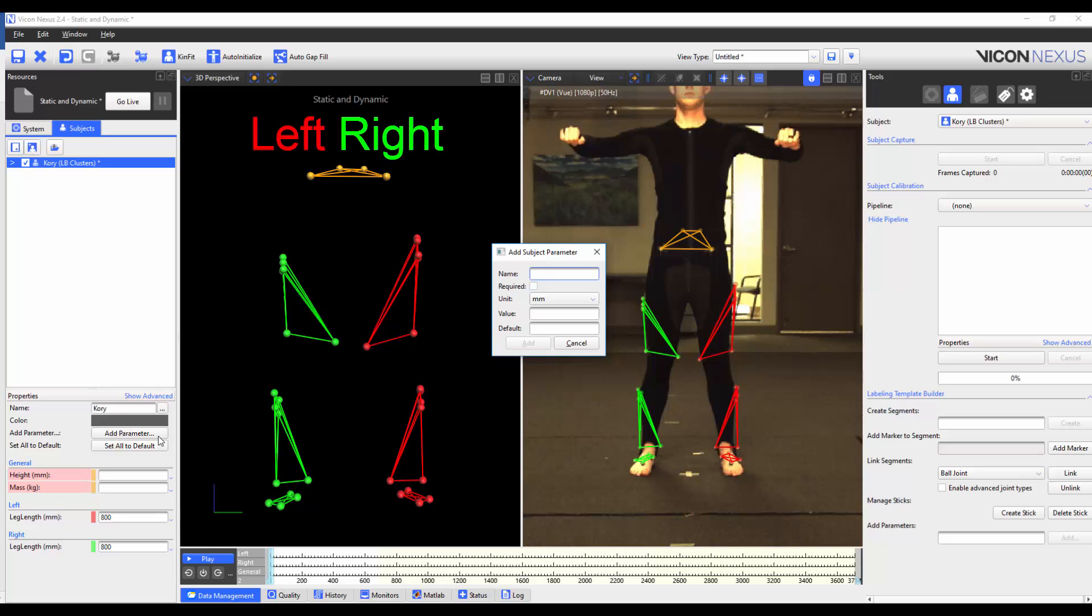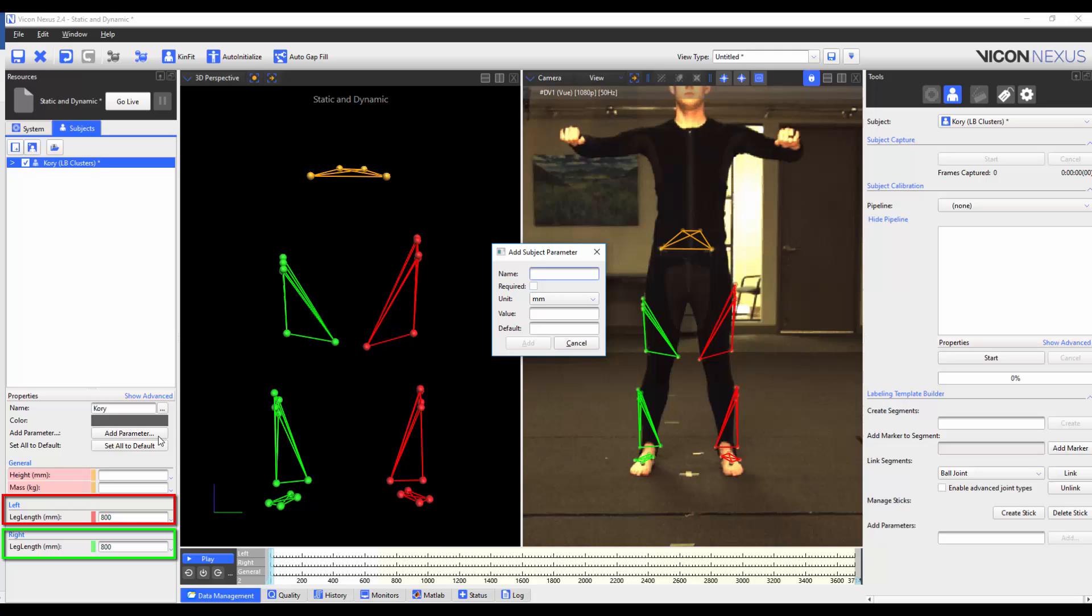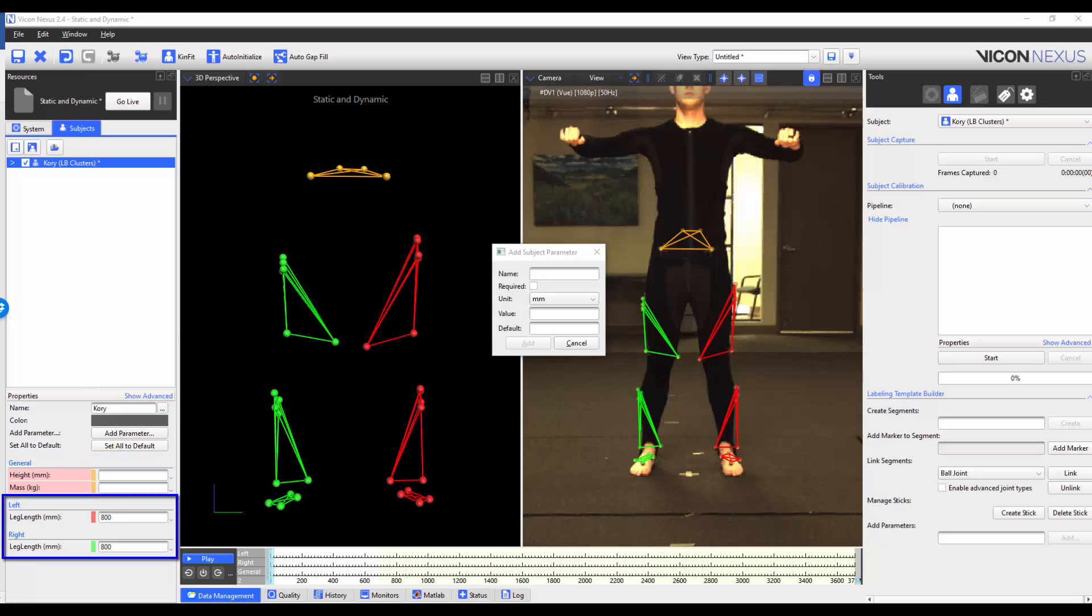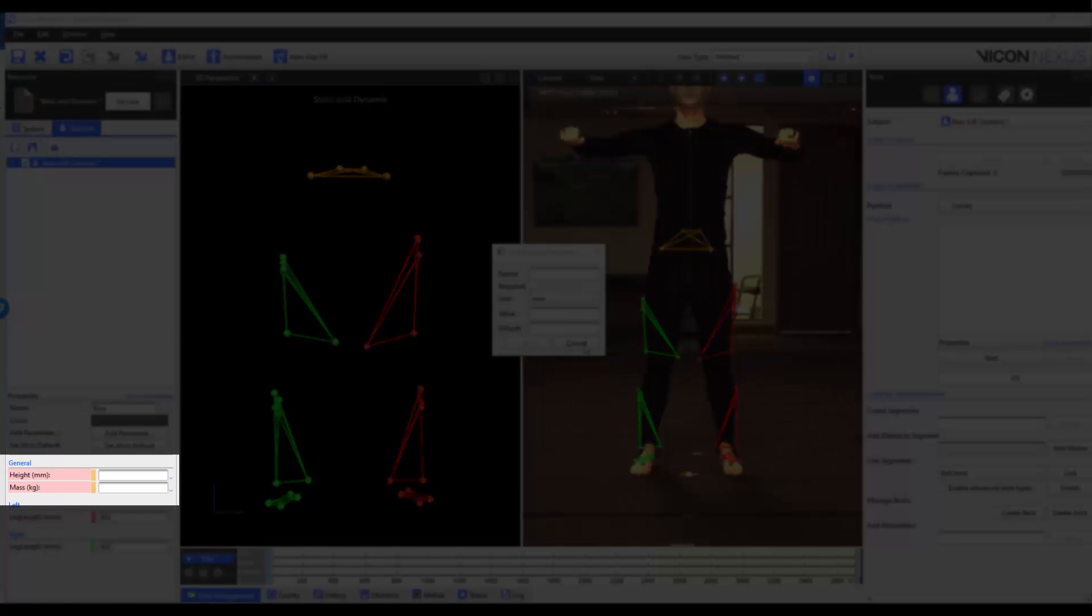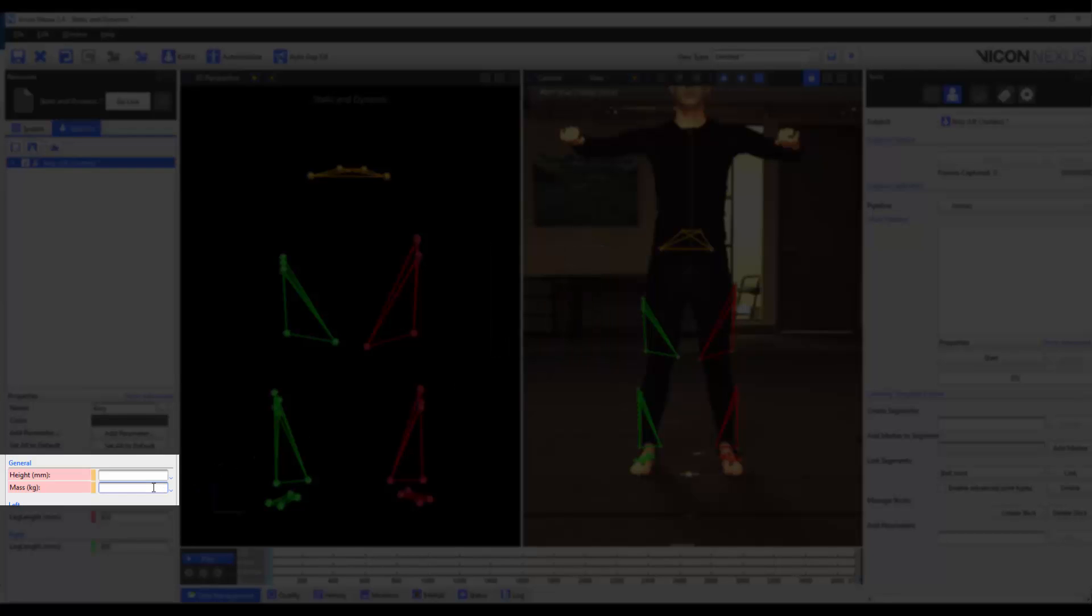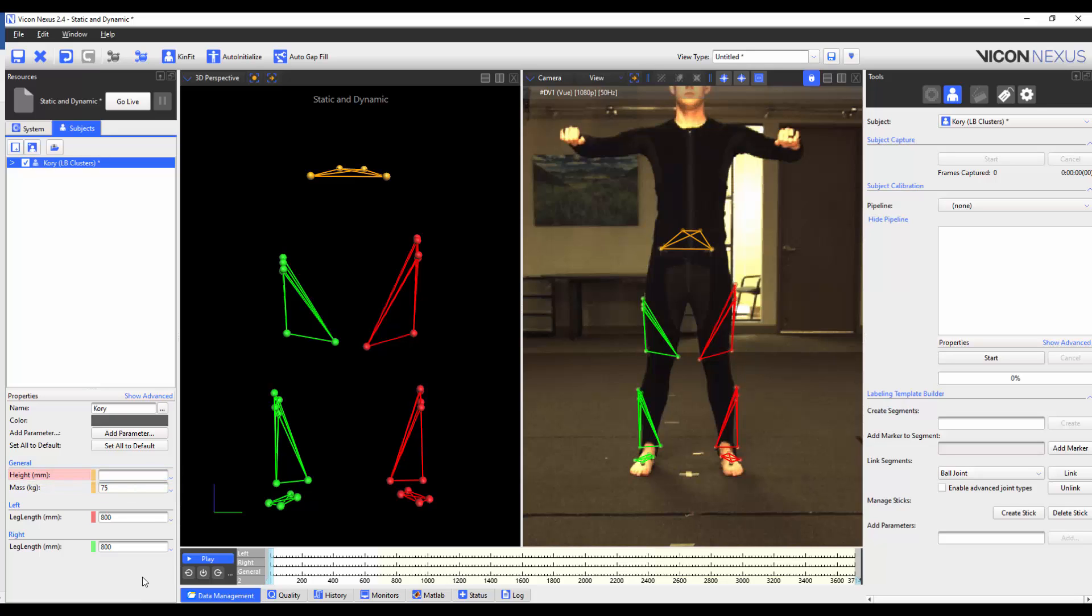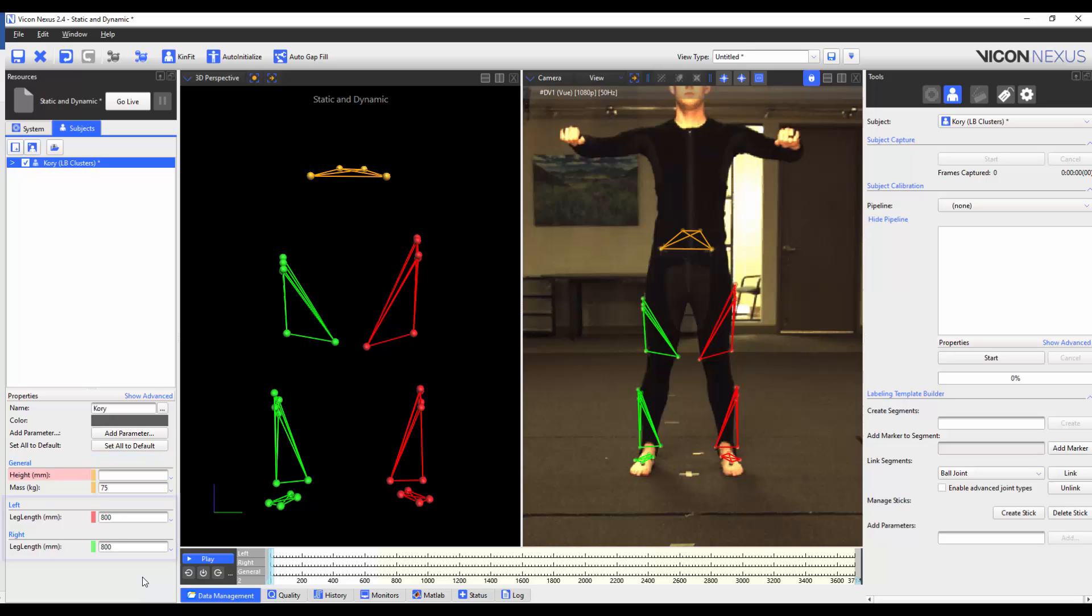When you enter a name, if you write the parameter with the word left or right all as one word, it will appear under the left or right heading in the properties list. If you don't have a left or right context, it will appear under the general heading. If you have the required box checked, the parameter will be in pink in the properties. In this example, the height and the mass are required properties, but the left and right leg lengths aren't. When a value is written in, the color reverts to the background color. You can also see that the units are appended to the parameter name, with height being set to millimeters and mass being set to kilograms. The value is a pre-existing value that appears in the subject parameters. In this example, there was no value set for the height or mass, but the left and right leg lengths were preset to 800 millimeters. This value can be overwritten.